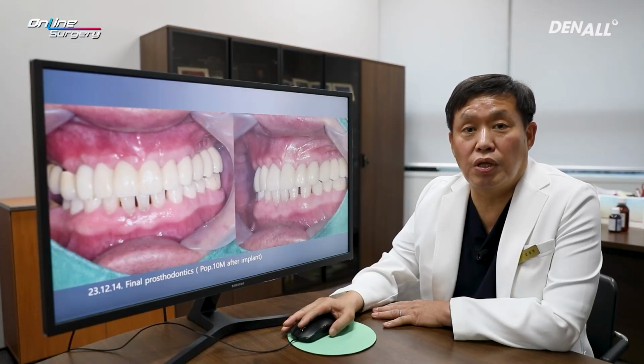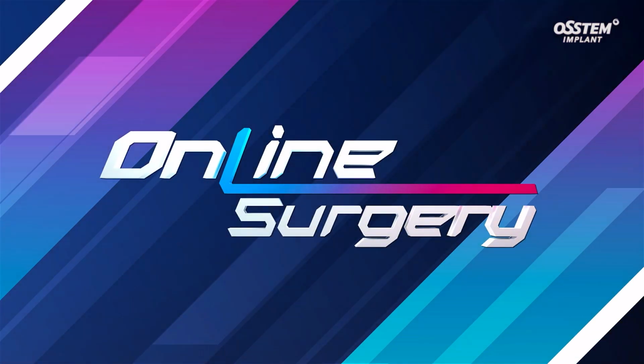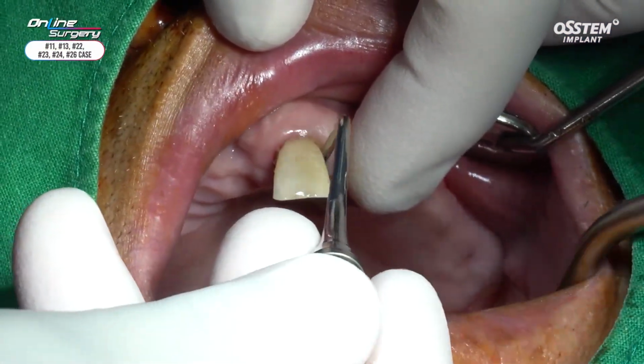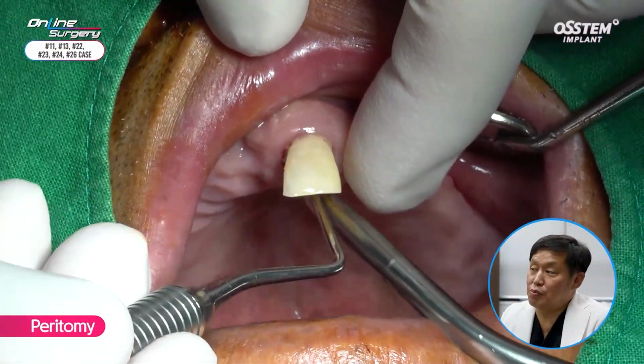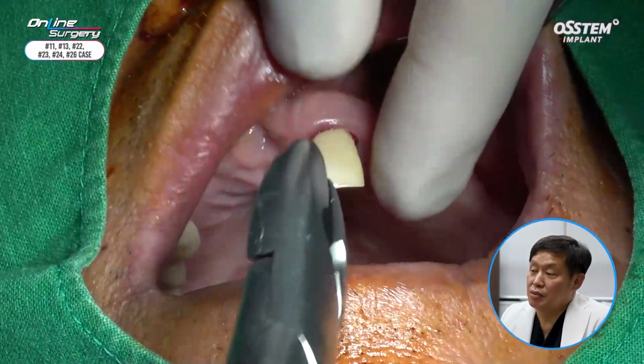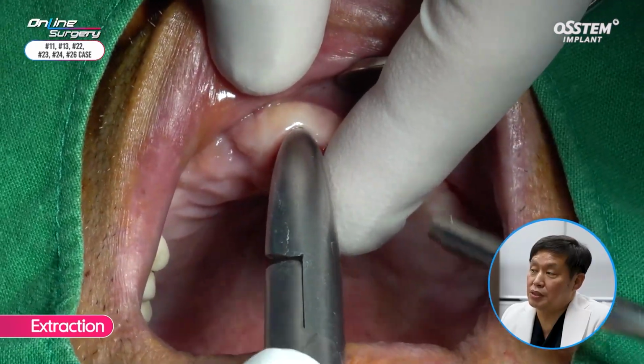Now we're going to look at the surgical clip. Please take note of how vertical anchors are utilized. Number 11 actually came out on its own. Peritomy was performed, and forceps was used to extract number 21.